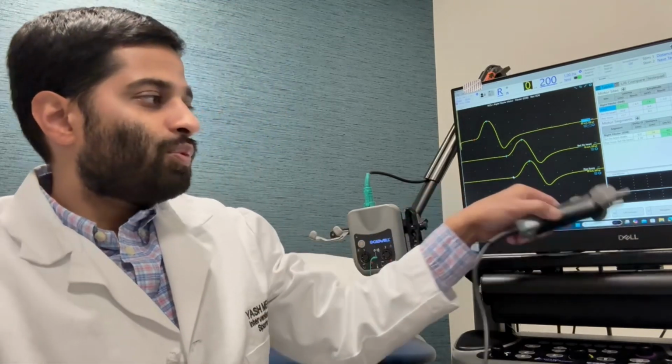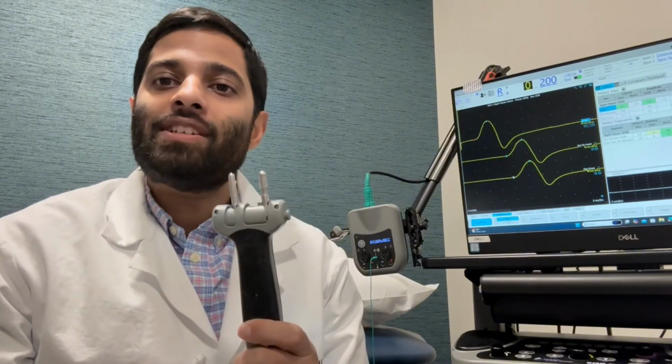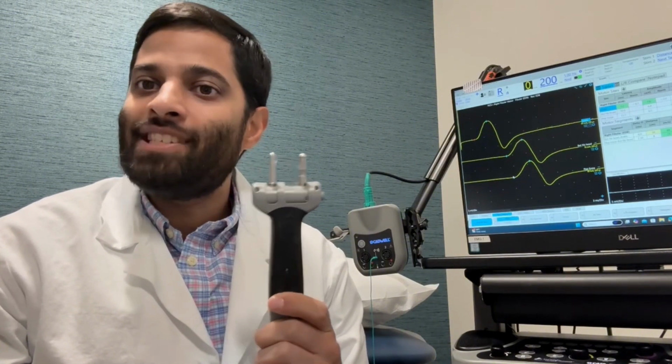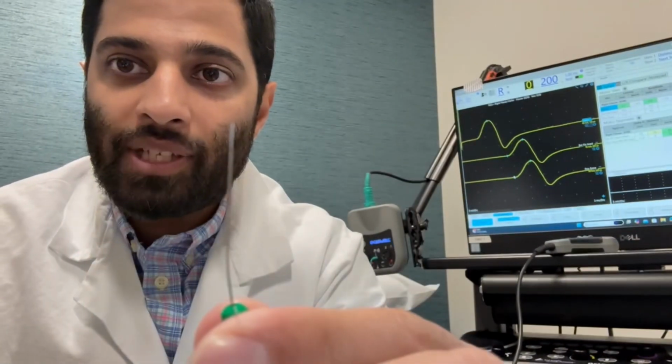The second question is, well, does the test hurt? Now, this is not a particularly painful test, but it's not the most pleasant experience as well, right? So for the NCS, we use this little small probe that sends some small jolts to test the health of the nerves. And patients usually say that this feels kind of like a TENS unit that they use. For the EMG, what we're using is a small acupuncture-sized needle that you can see right here. And that's what we're using to sample some of the muscles to see the health of the nerves in the neck and the low back.